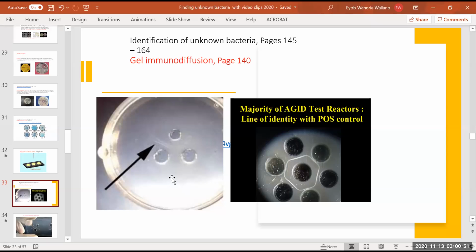The technique here, I'm going to explain that also. Look at this one. For example, these can all be antibodies or all antigens, and then this is antibody. So this antibody is going to recognize all the antigens. Or this is antigen, and these are all antibodies recognizing, and they are making precipitation. Isn't it interesting? Very beautiful. So that is how we say immunodiffusion or gel immunodiffusion. Well, this kind works in so many ways, really.